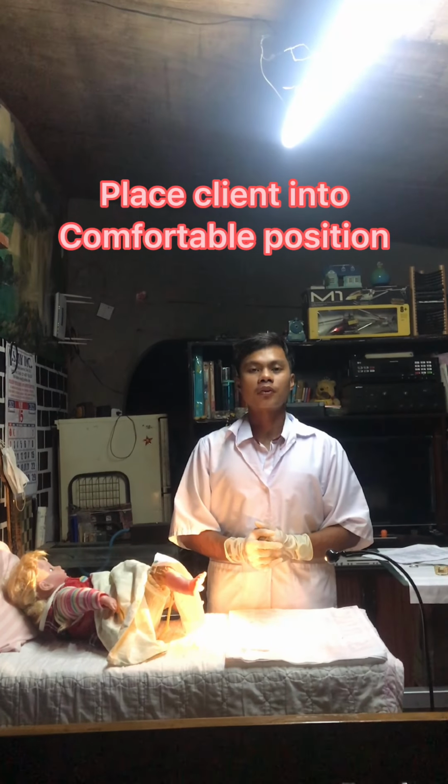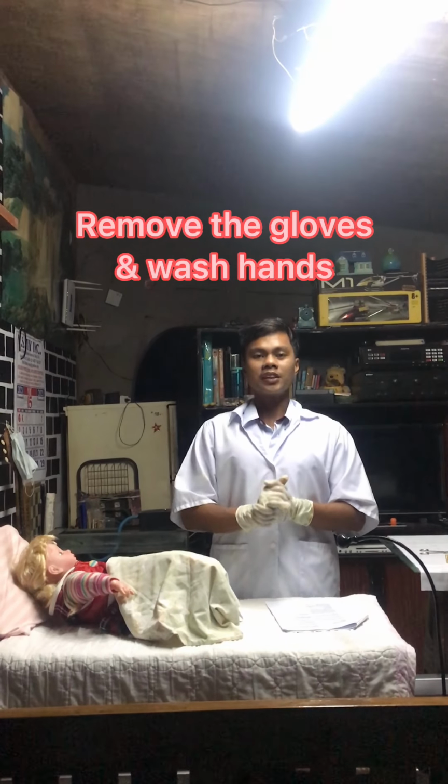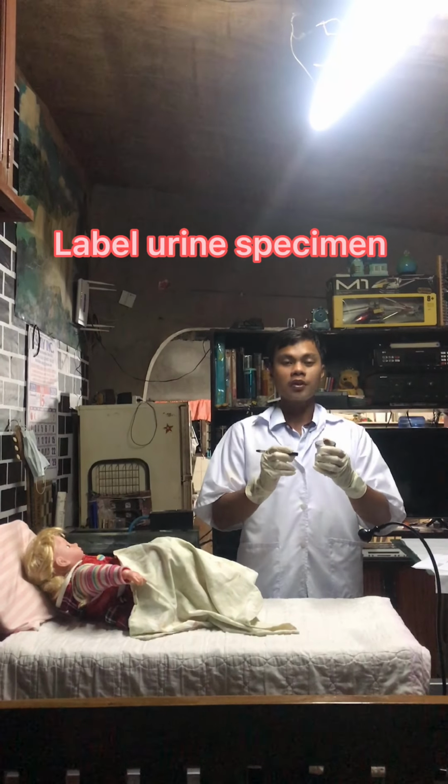Next, place the client in a comfortable position and do the aftercare. Then remove the gloves and wash hands. Label the urine specimen and report to the laboratory promptly.